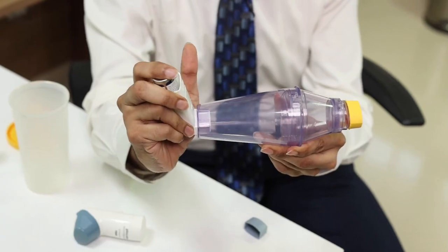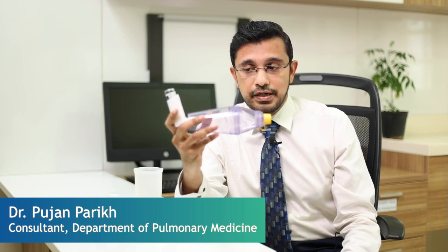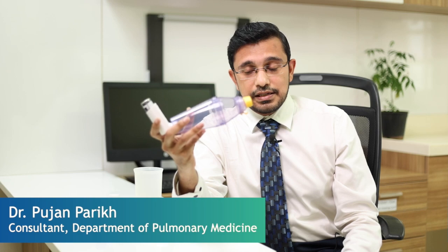So this spacer basically retains the medicine, so that if the coordination is not proper when we press the inhaler, the medicine will come into this chamber and the patient can breathe in and breathe out 4 to 5 times, and the drug will be properly delivered. This is very useful for the pediatric and elderly population, those who are not able to coordinate their breath when the inhaler is pressed. As per the GINA guidelines, this can be used in asthma attacks also. It is as good as a nebulizer in delivering the drug.